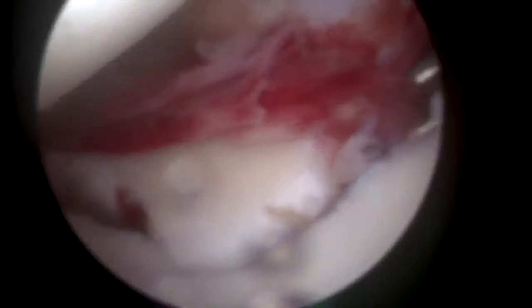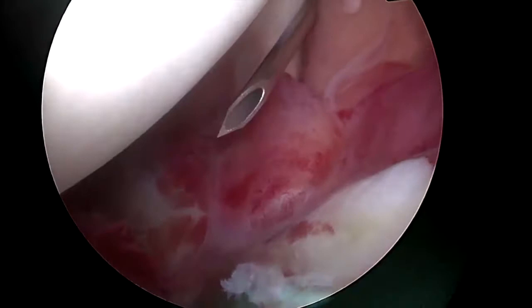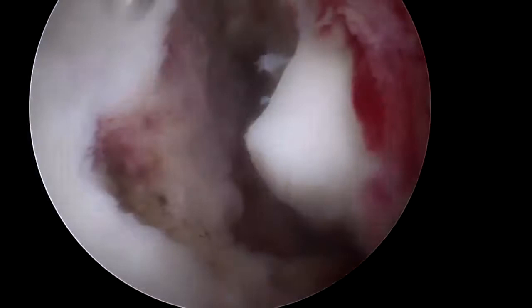An anterior inferior working portal is then created just above the subscapular tendon, one centimeter medial to its humeral insertion. The arthroscope is switched to the anterior superior portal to have a global view of the glenoid and the fracture.